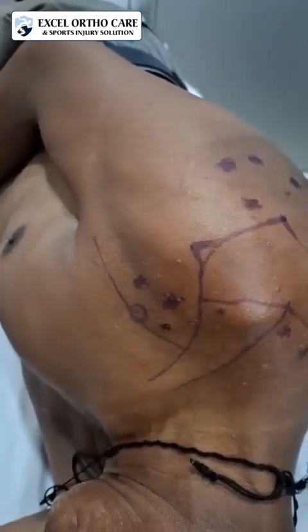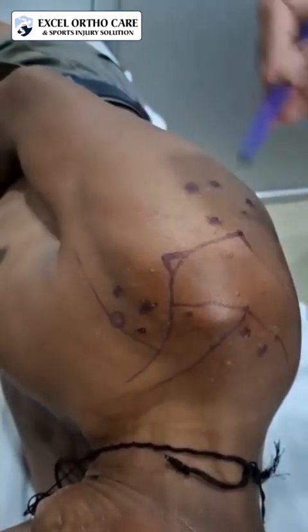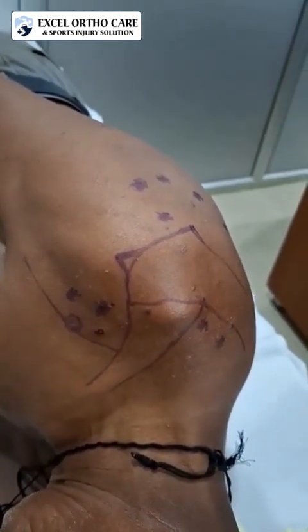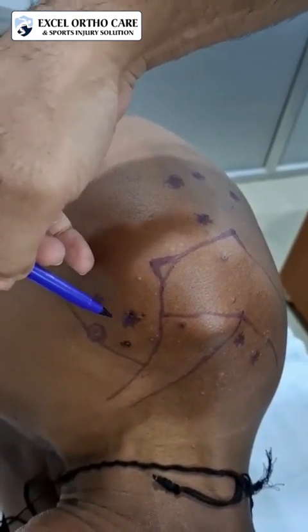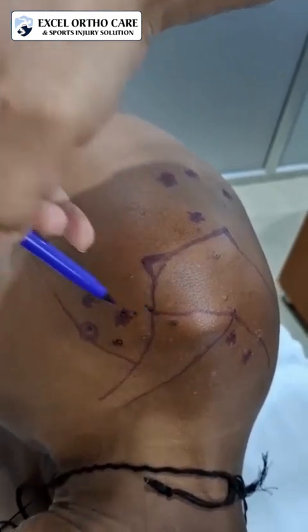The second important point is that the posterior portal is the only one made blindly. The rest of the portals are made by viewing inside the joint, by the outside-in technique. The next portal that is made is the anterosuperior portal. The anterosuperior portal is midway between the coracoid process and the AC joint.